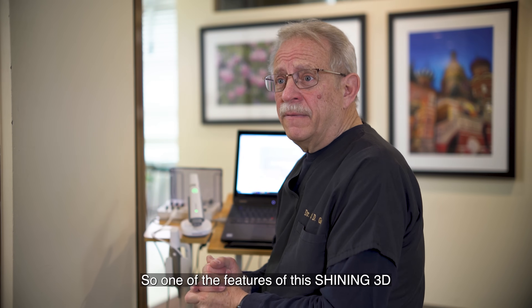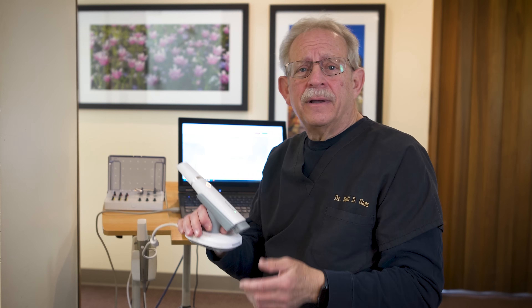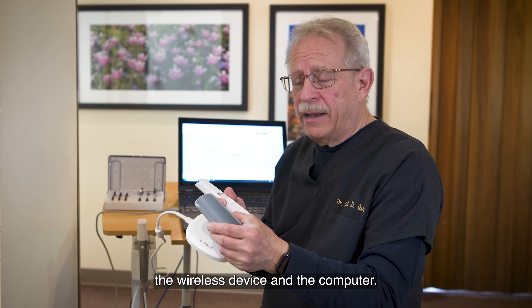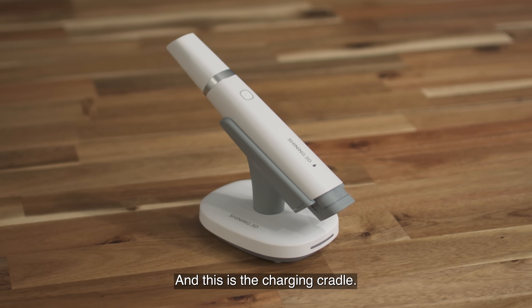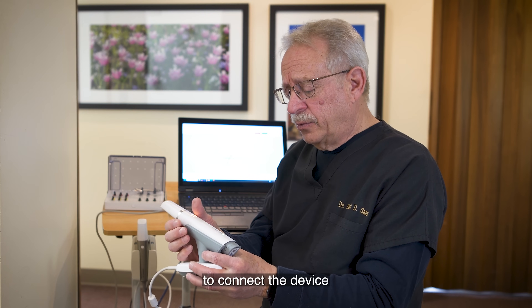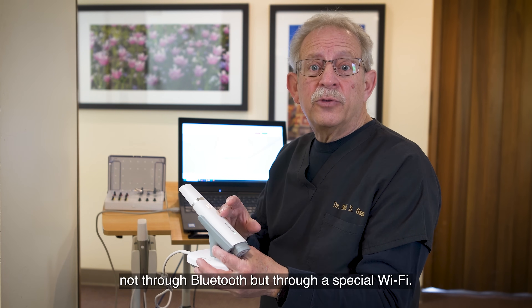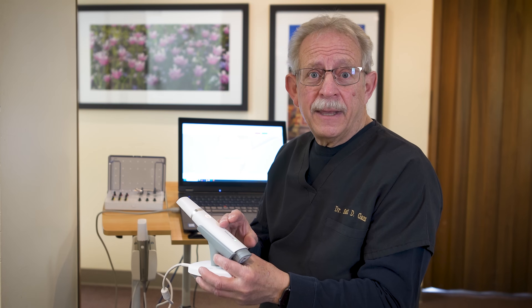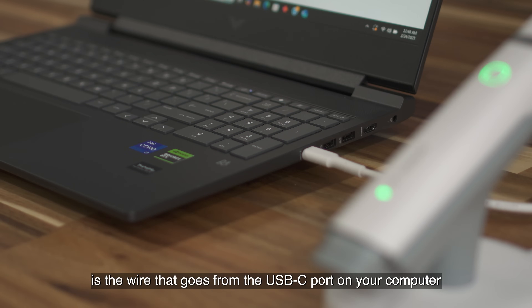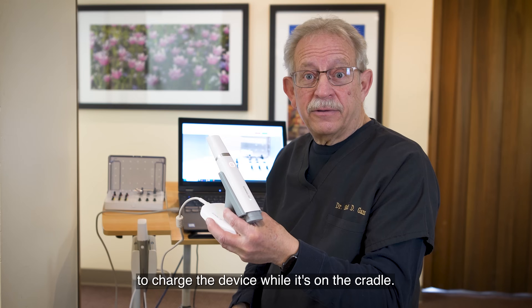One of the features of the Shining 3D wireless intraoral scanner is, of course, the connection between the wireless device and the computer. This is the charging cradle. It's really innovative because it connects the device not through Bluetooth, but through a special Wi-Fi. The only wire is the USB-C cable that goes from your computer to the charging cradle, which also charges the device while it's docked.